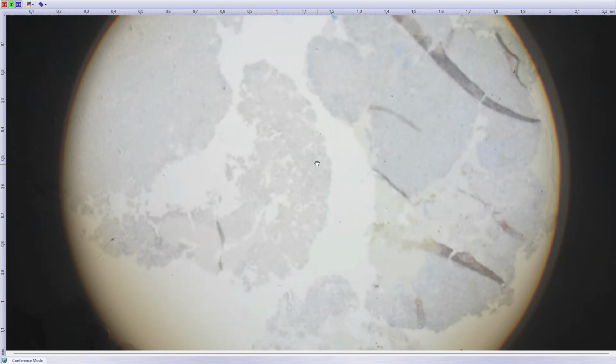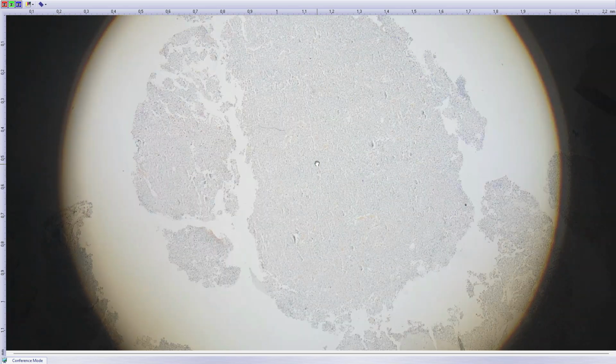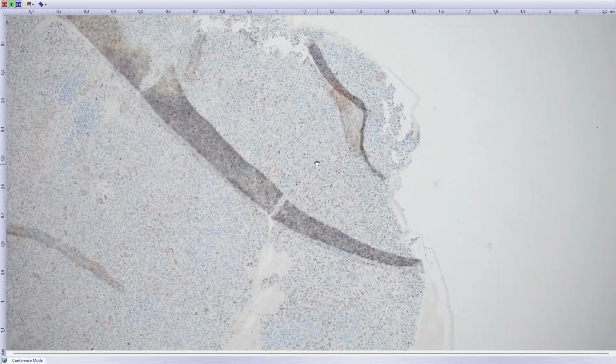phosphaturic mesenchymal tumor. There is no magic immunohistochemistry for phosphaturic mesenchymal tumor, but these tumors tend to be positive with SATB2. SATB2 is a marker of osteogenic differentiation. So there was some SATB2 expression. This marker is quite non-specific, so it doesn't mean that much, and it's not very diffuse in this case, but it's there. It's unquestionably positive in some cells.